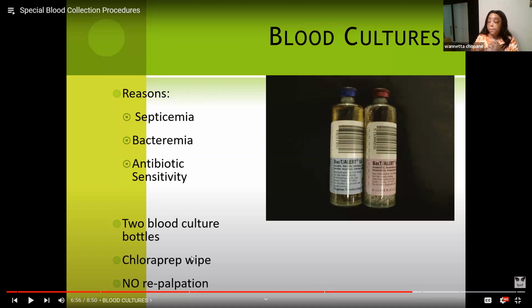With that being said, the tops that you see on these blood culture bottles, you will pop the top, and then it'll have the clear rubbery covering that we already see on our needles that we tie our holder to. That's where you would put your transfer device so the blood can go inside the tube.